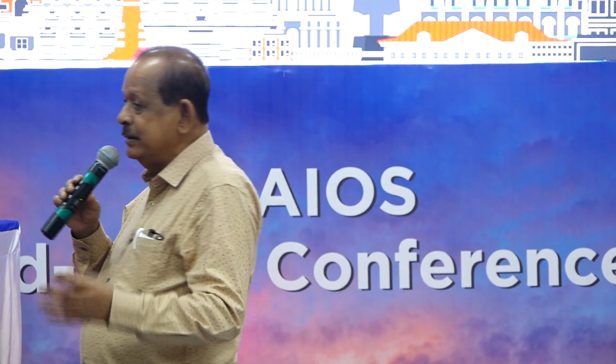Another thing is the SIA, say an SIA of 1.5. With a straight incision and an opposite OCCI, you can correct up to 1.75 cylinder, so you don't need toric lenses. So cost optimization is a great benefit. And if your microscope is not good, I think you better do SICS. In compromised situations, do SICS.